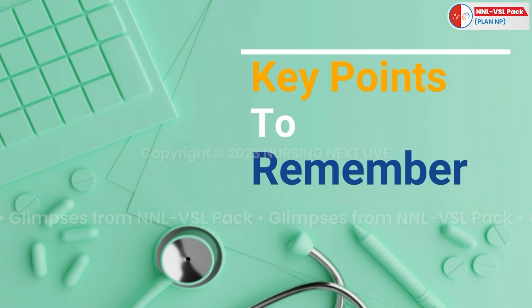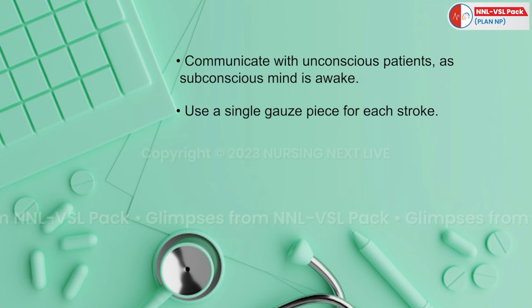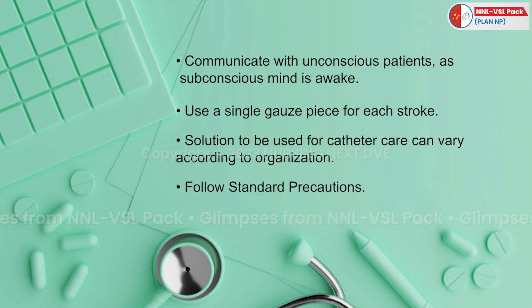Key points to remember. Communicate with unconscious patient as subconscious mind is awake. Use a single gauze piece for each stroke. Solution to be used for catheter care can vary according to organization. Follow standard precautions. Maintain patient's privacy.